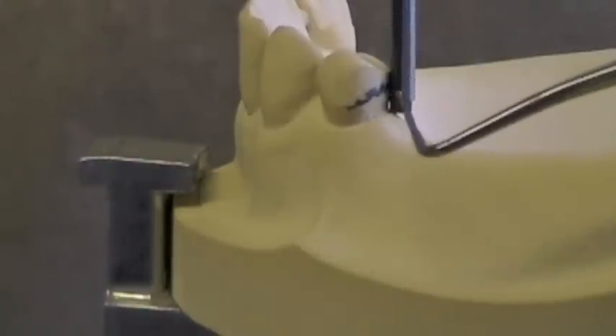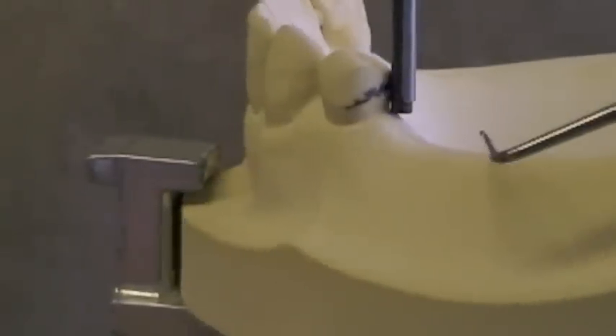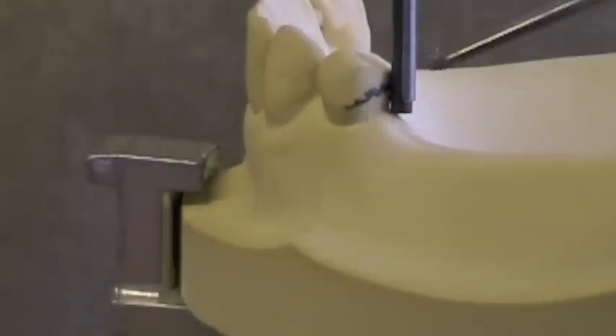For distal extension cases, we still want a 2 to 4 mm guide plane, but we want to keep some triangular space down at the bottom so that there's some place for the partial denture to rotate in. The main principle for distal extension cases — Class 1 and Class 2 — is to make sure your guide plane doesn't go all the way down to the free gingival margin. You still need 2 to 4 mm height for your guide plane, but you don't want it going all the way to the free gingival margin.